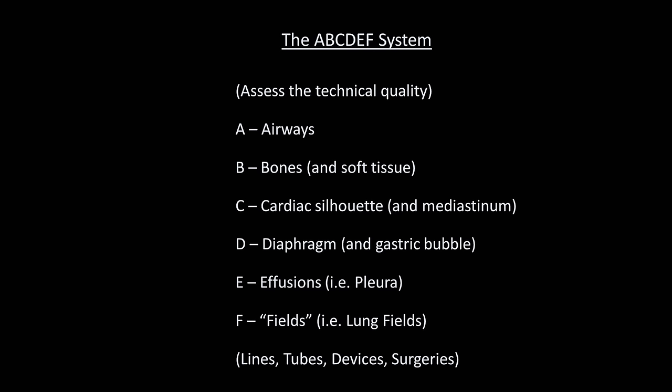Aside from the fact that it's easy to remember, another nice thing about this mnemonic is that the lungs are examined near the end. This is a good idea because normally the lungs are the area of greatest interest and the most likely to be abnormal. Therefore, once the clinician finds an abnormality there, it's very easy to forget examining the rest of the film. I've seen more than one rib fracture missed due to distraction over acute lung pathology.